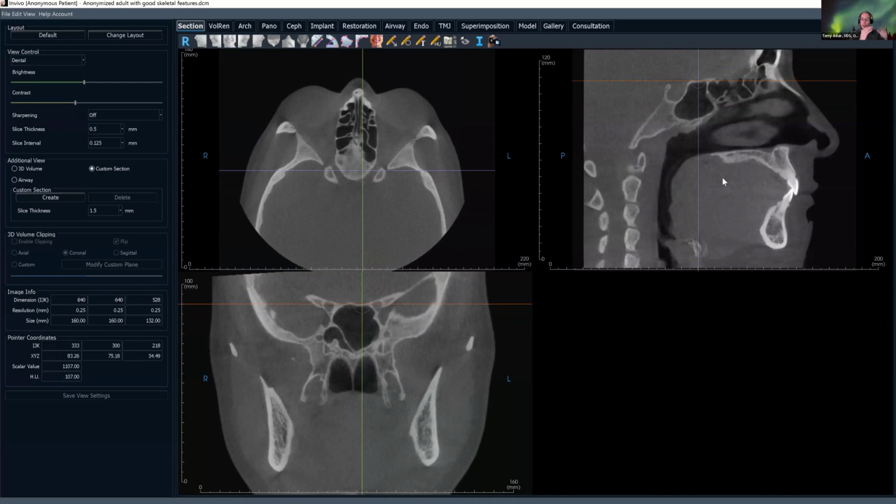I want to go through each of these planes, and even though all the anatomic structures are in each of them, they're presented slightly differently. And I think that it helps to be familiar with what they look like in each of the planes. Although when I'm doing my actual scrolling, I am focusing on one particular part of the anatomy. I don't try to take everything in at one time. And those of you who do and can, that's great. It's just too much for me.